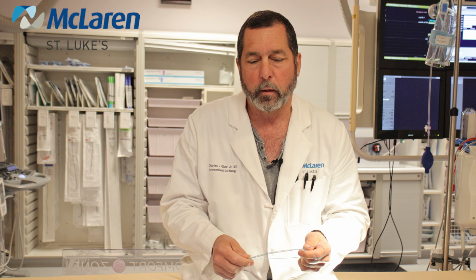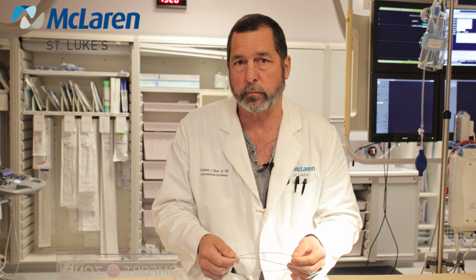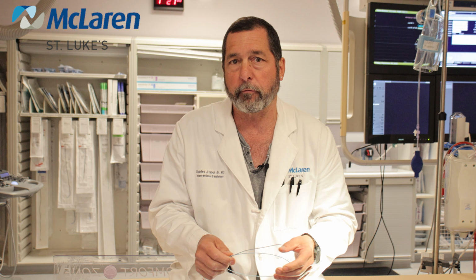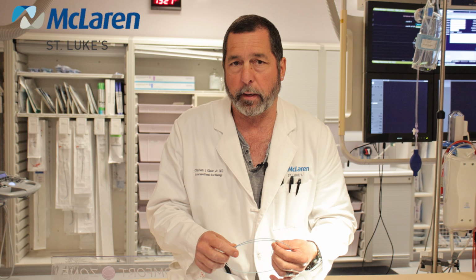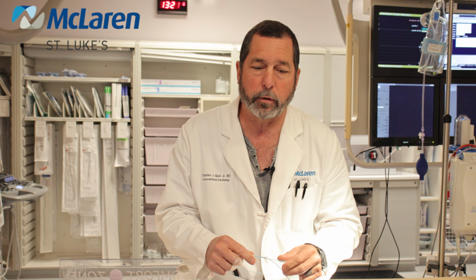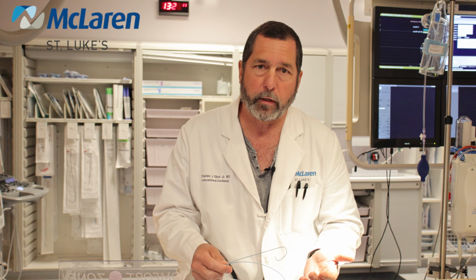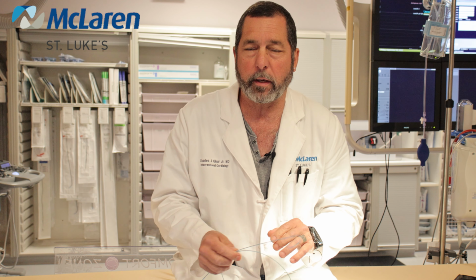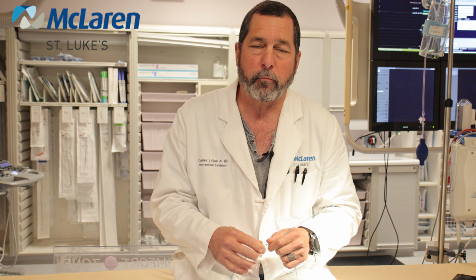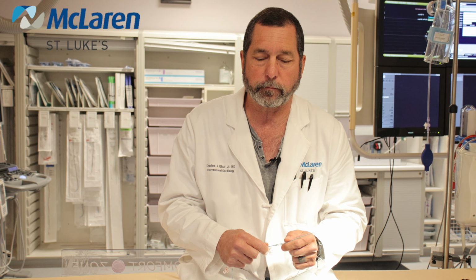After that, the technicians will come and they'll take out the catheters, and you'll go back to the recovery area and you'll have to lie flat for a certain period of time. Most people get to go home several hours after the procedure. I really ask that you don't do any heavy lifting. If we go through the groin, you can get back to your normal activity usually after about 2 days. If we go through the wrist, you can't use that wrist for a couple of days, but you can do most other activities.